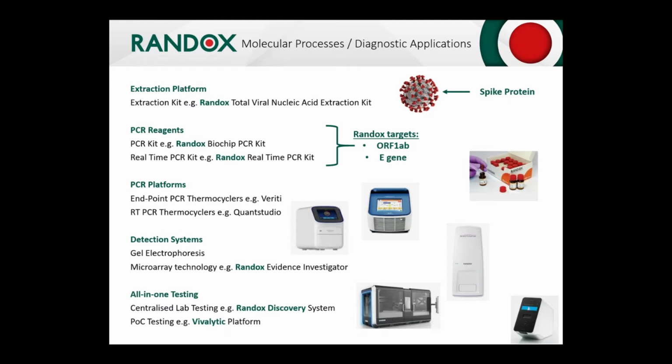So again, it's perfect for medium-sized hospitals that maybe have got an intensive care unit where a result is wanted pretty quickly to determine the infection status of a patient. The great thing about those types of machines, either if it's point of care or the larger machines that you mentioned, is essentially the lab staff can get a little bit of pre-work done beforehand, and let the machine go to work, and then they're freed up to go and look at other tasks that have to be taken care of within the lab as well. So then they can basically wait until the full cycle is done, and it's just a matter of retrieving the results back off the system.